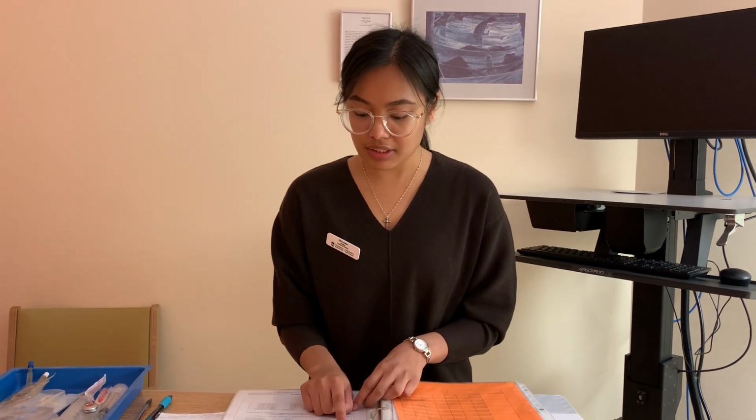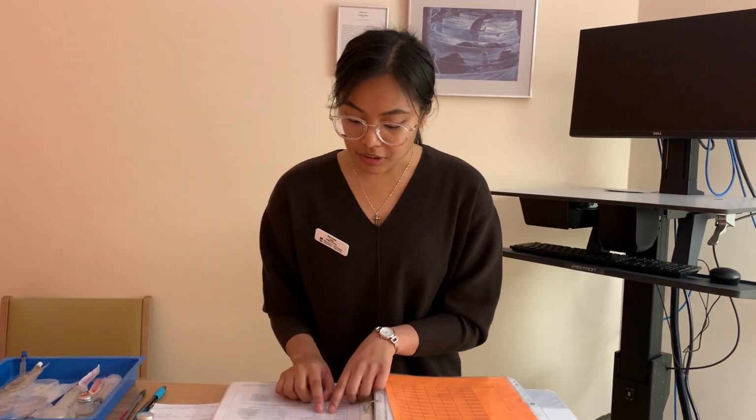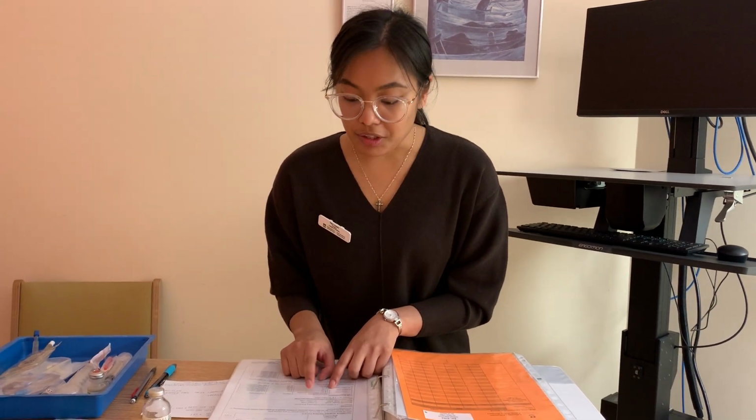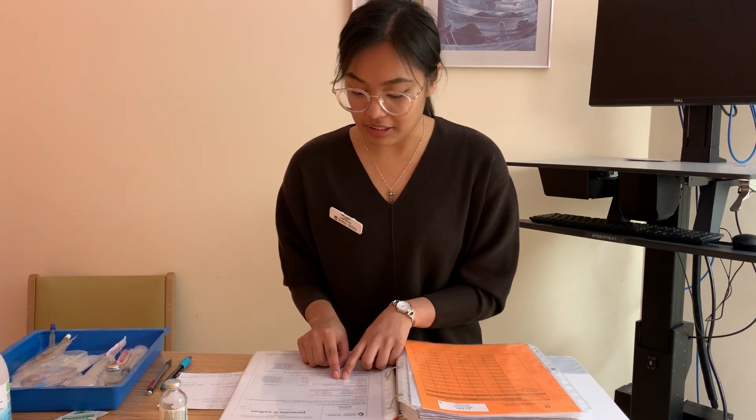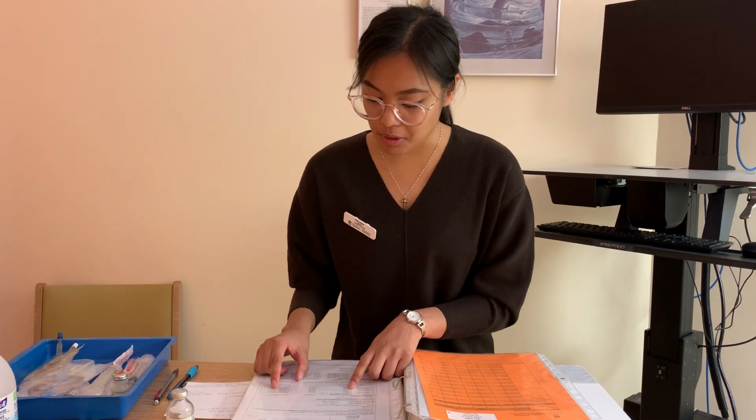Reconstitution, dilution, and administration is applied as a 1, 5, and 10 million unit vial. I have a 5 million vial here. So for 5 million units, I need to inject sterile water, normal saline, or D5W, 8.2 milliliters in my vial for a volume of 10 ml and a final concentration of 500,000 units per milliliter.